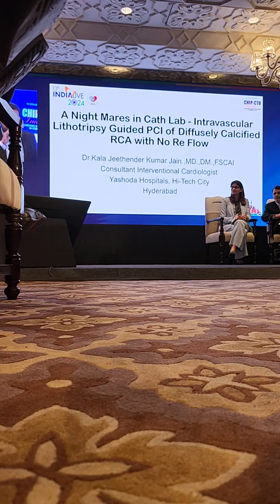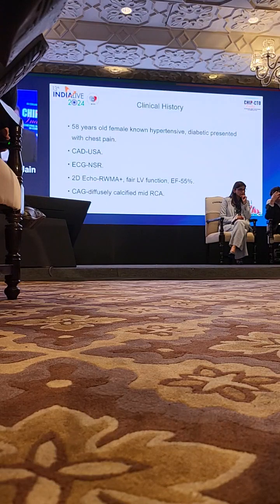Good evening everyone. My case is a case of calcified RCA, which was referred from an outside center. This is a 58-year-old female patient with multiple comorbidities, diabetic and hypertensive, who presented with chest pain and was diagnosed outside as CAD, unstable angina.